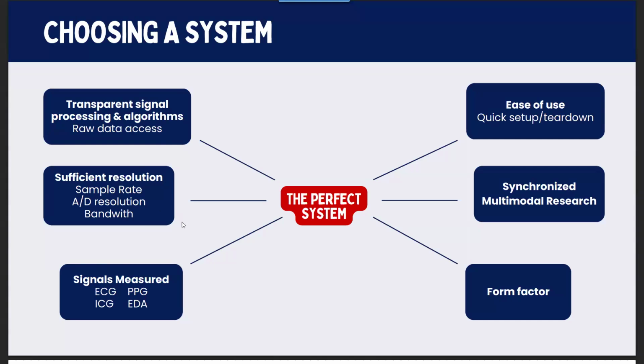On these commercial PPG devices, they may be sampling at considerably lower sampling rates than what you're used to with our mobile and Biopac solutions. Because of that, we will only have so many points or samples where we're able to see the waveform.